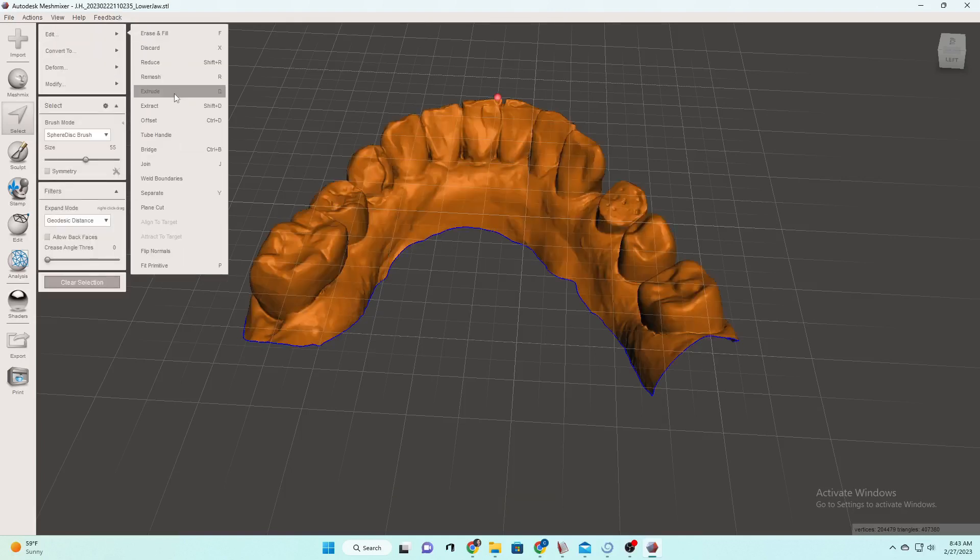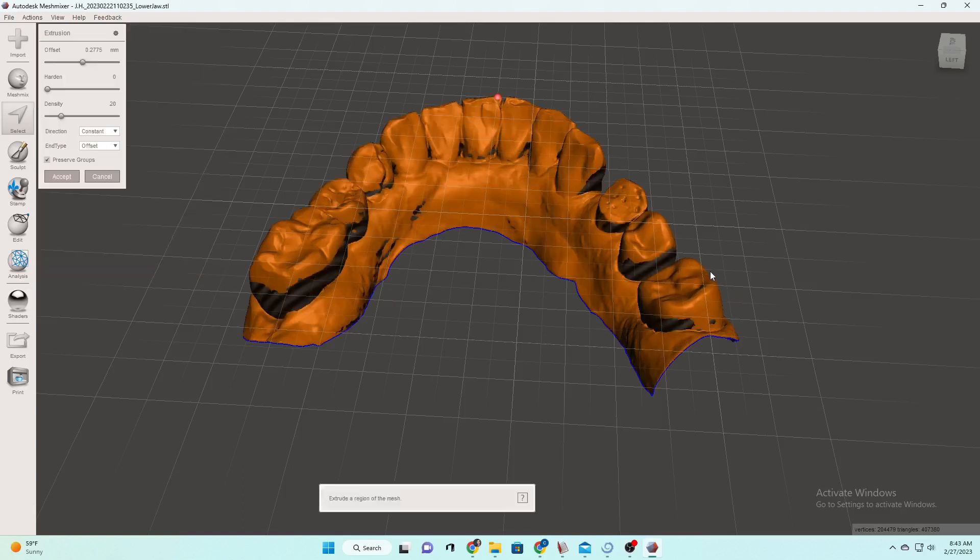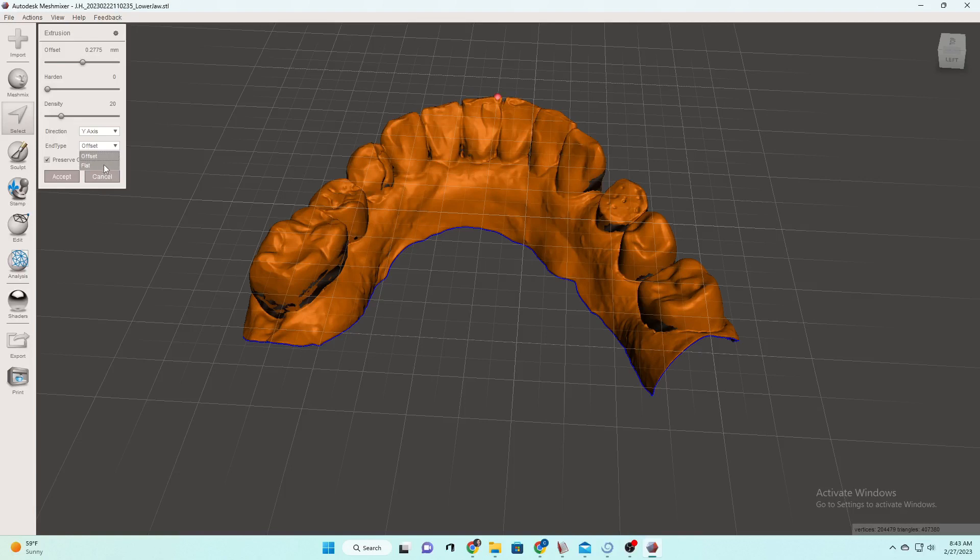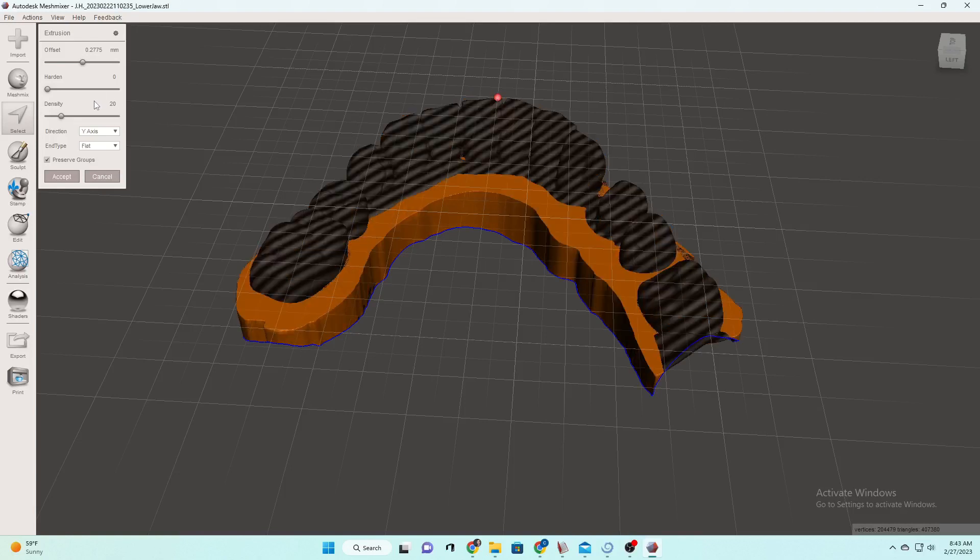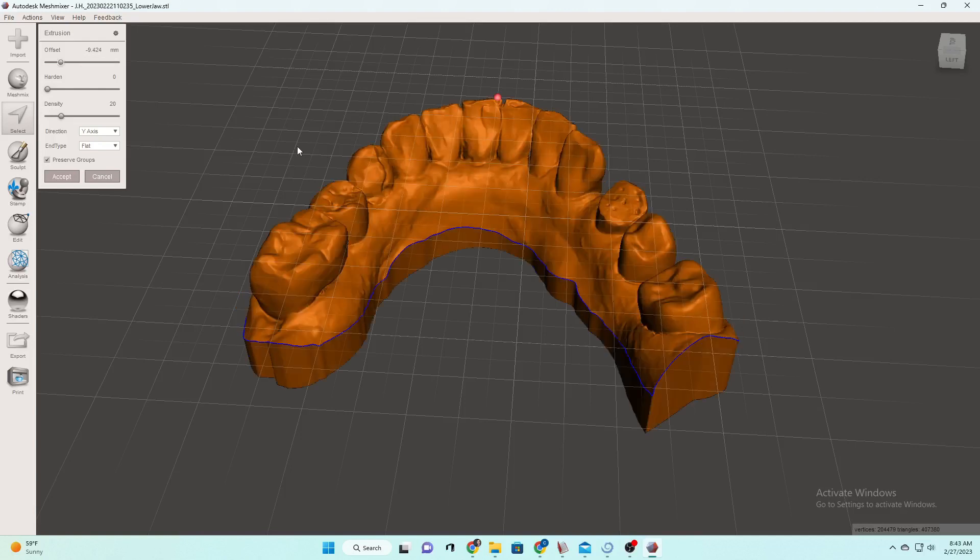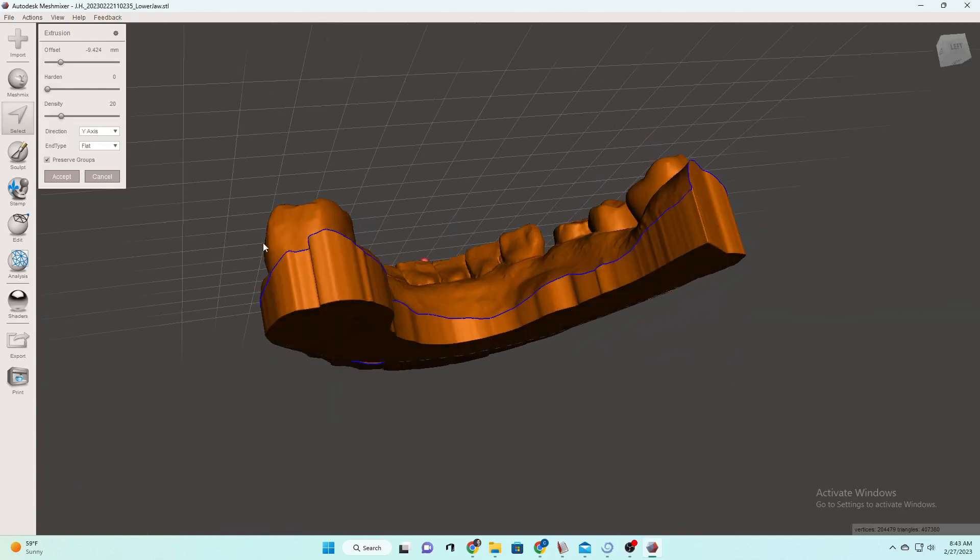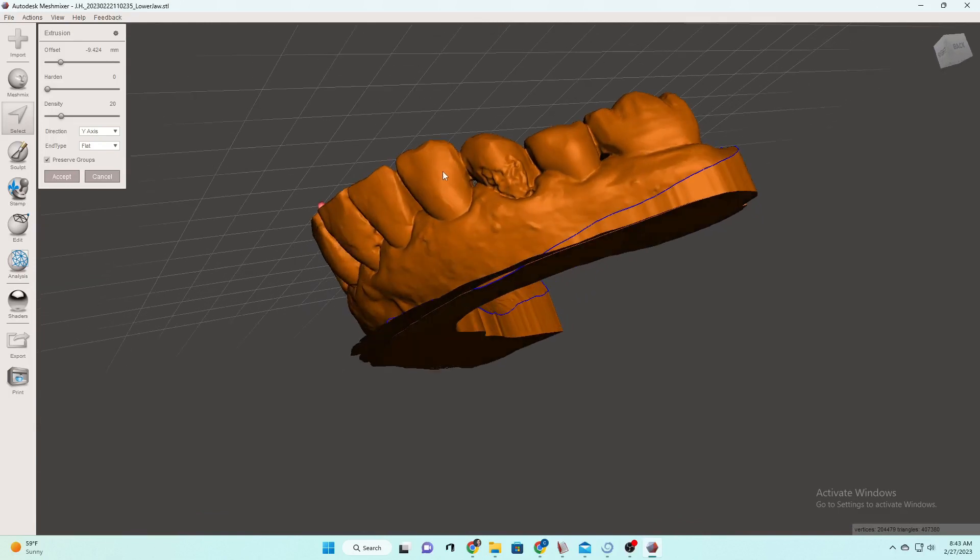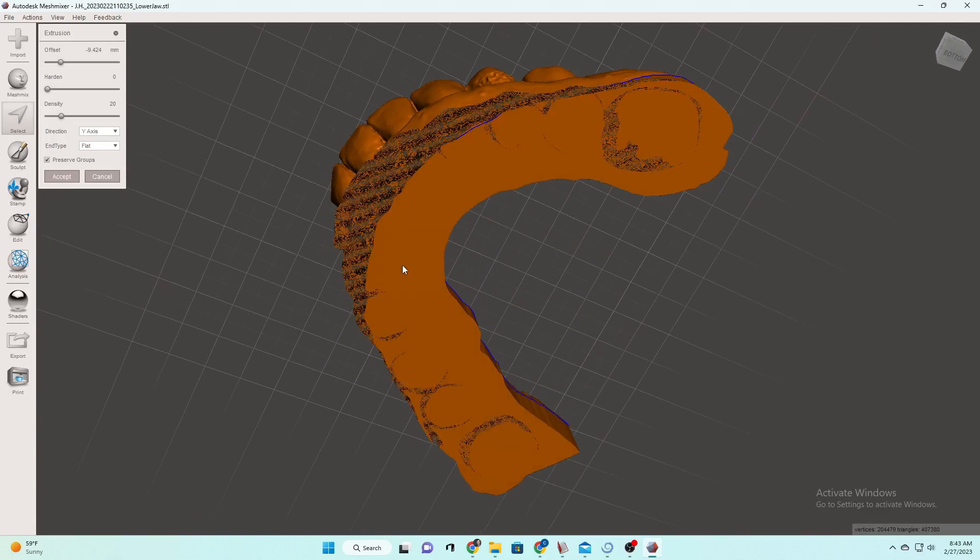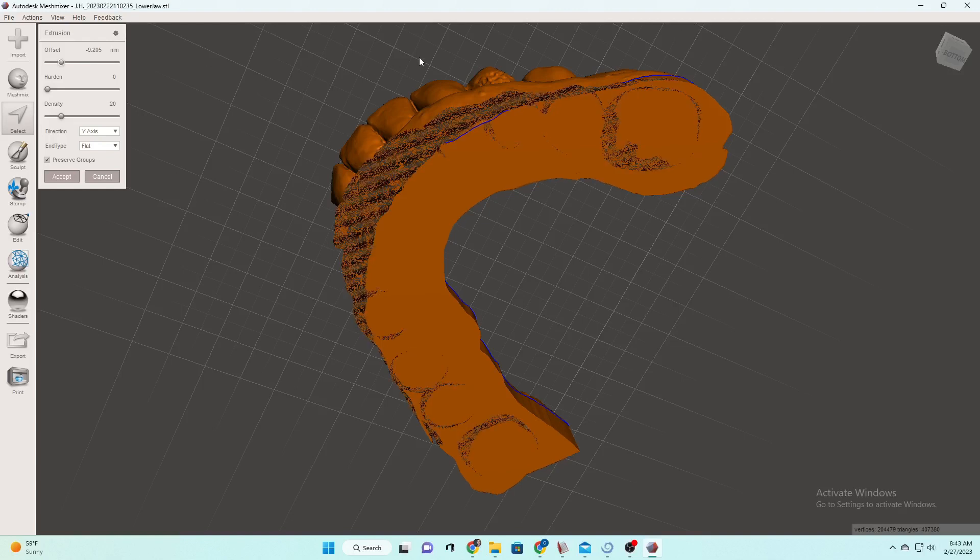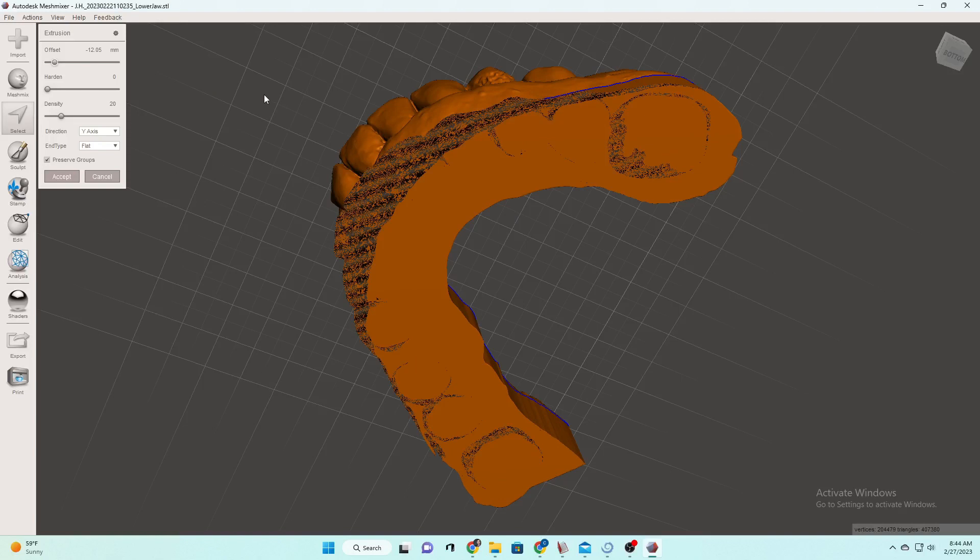So now we have made this model and now we need to put the base on. It's still a hollow model. So select all of it and extrude. It's going to be confusing at first when you start learning this, just because it's something so different than we're used to. Extrude y axis and flat. That's telling it where to set it flat, where to stop that extrusion at. And with the lower, you'll need to be more towards the left side. So see, it brings it down past that blue margin. We want to get down below that blue margin to make a solid model.